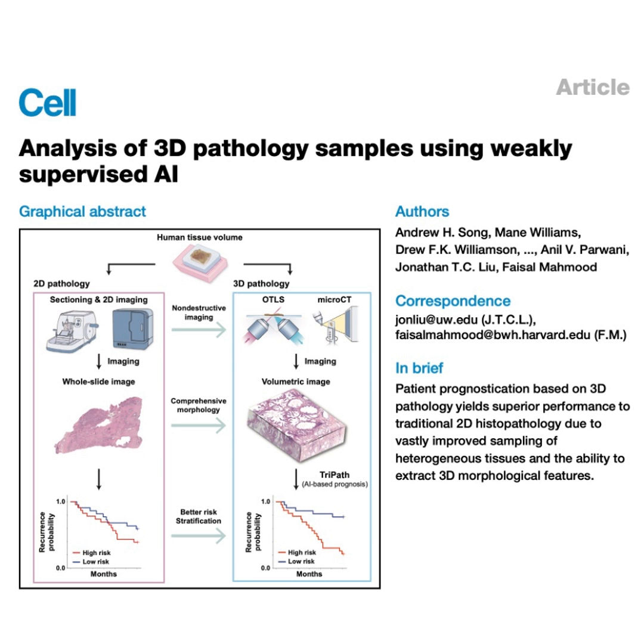TriPath Whole Volume 3D achieved an AUC of 0.749, which again significantly beat its 2D baselines and the clinical Gleason grade baseline for that cohort, which was AUC 0.712. So the benefit of 3D analysis holds up even with different imaging tech and lower resolution. It seems pretty robust. Very robust. The core advantage of analyzing the whole volume in 3D seems consistent across modalities.